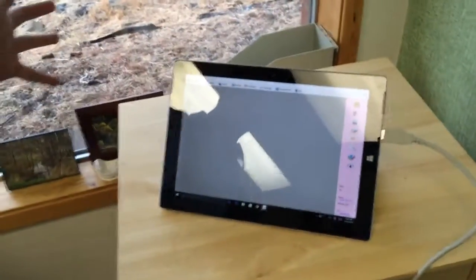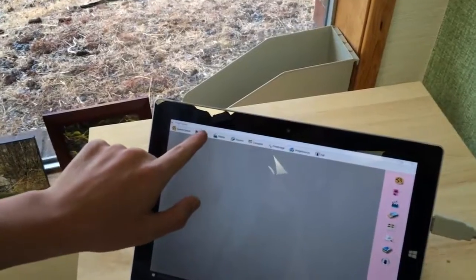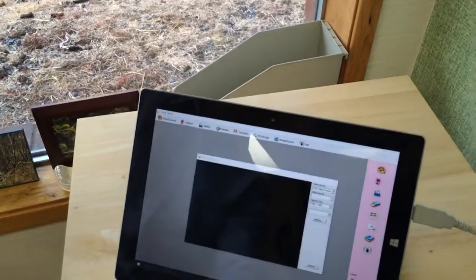And this is going to be any patient. You can always search for a patient. You can search for different things. But just click his name, hit Enter right here. And now this is a new patient's screen. There's no pictures yet. And so all you need to do is click Capture, just like that. And it's going to pull up a capture dialog box.